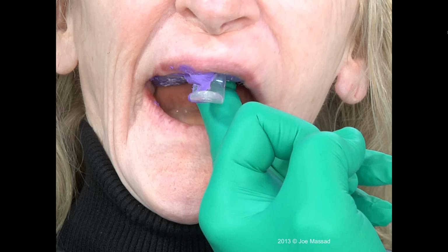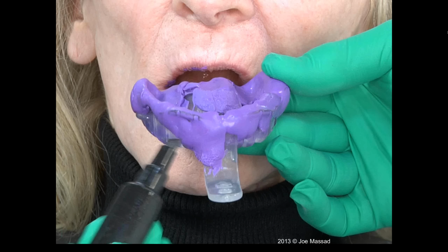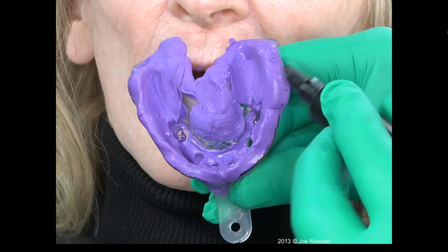And when I do that and remove the tray, I will see where the functional pressure area is, which I've identified before I even do my final wash, and then a very small area off of the top of the border of the tray to allow my final wash to flow very naturally. So now I've done this. I've cleaned it up, and I'm ready to do my final wash.